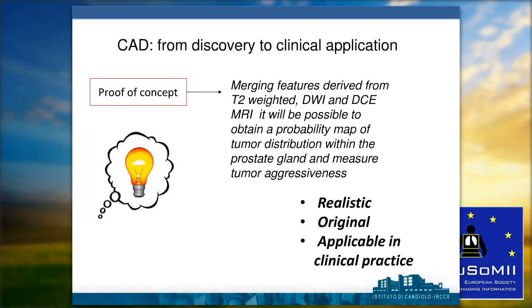And so we started again. We said, well, what's the idea behind developing a CAD system for prostate cancer based on MRI?